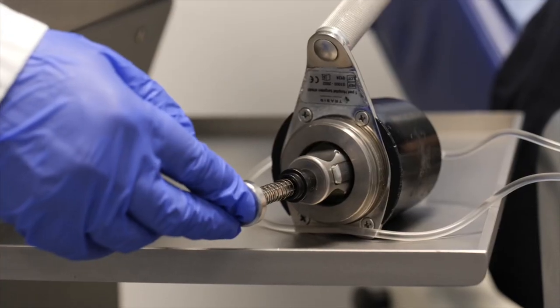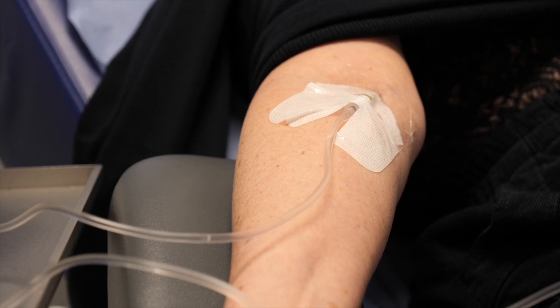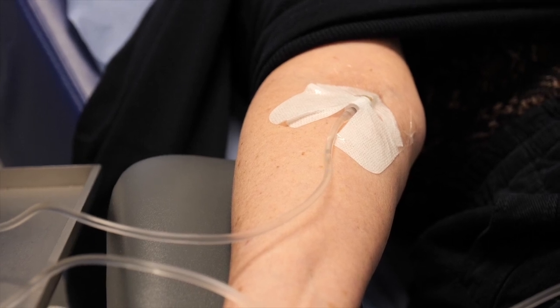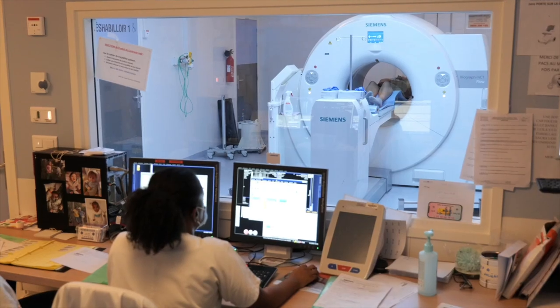Curium produces these molecules each night, which allow patients to undergo a PET scan. The patient is then injected with the radiopharmaceutical in order to obtain images required for diagnostic purposes.